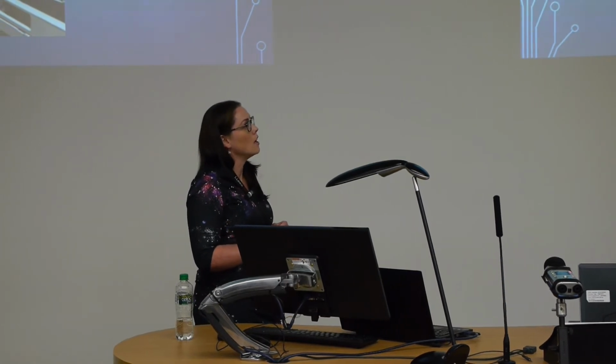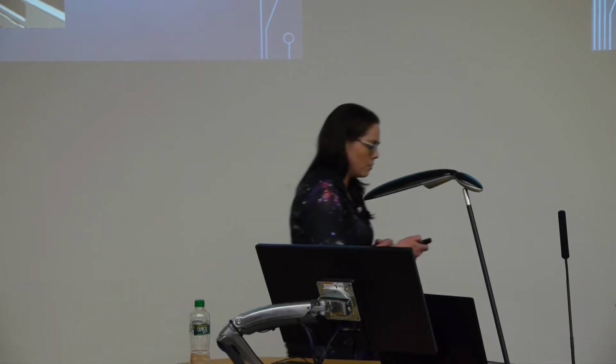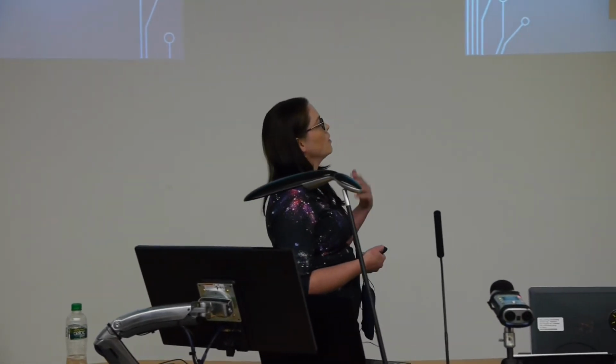So in the past, you CT'd your patient and you went off and you planned them, and then they came back for treatment two or three weeks later, and you hoped that inside they looked the same as they looked before, and you didn't really know. Whereas now we can actually image our patients on the treatment couch before we treat them, and then you can make judgment decisions about whether your treatment's going to work or what you need to address, so you're bringing it back to the patient and their features.